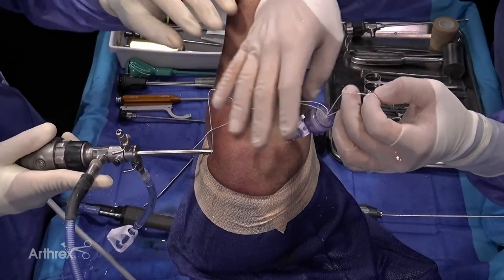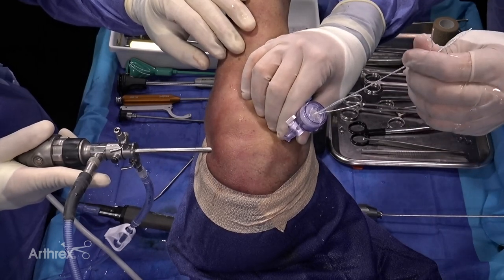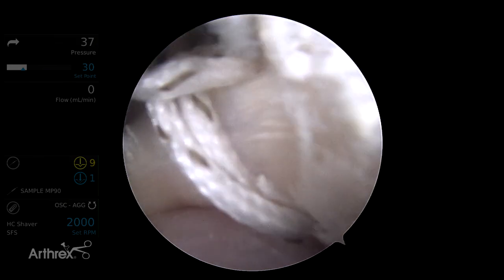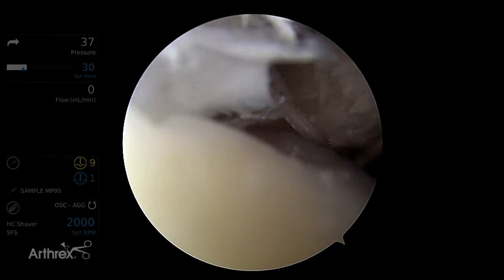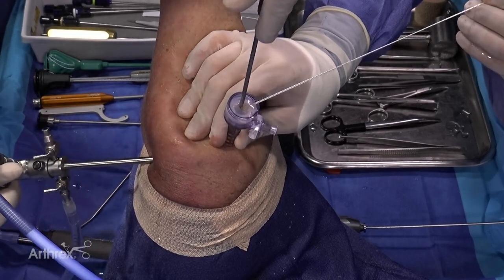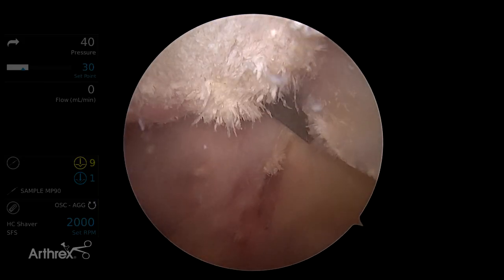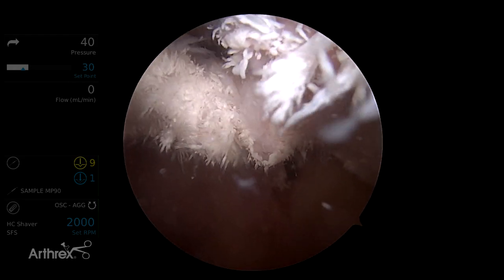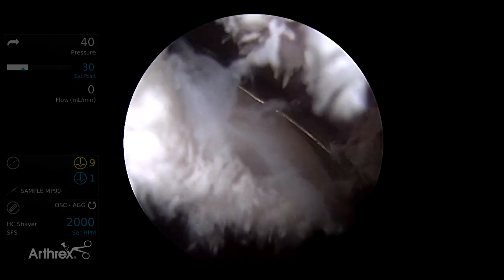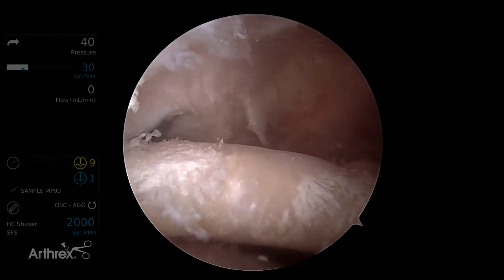You can see how you pass those limbs through the loop, and we'll alternate tension to bring that half-racking suture down to the biceps tendon — alternating tension will cinch the suture down to the tendon. I'll pull those sutures in line with the tendon and then cut the biceps tendon at the base, flush with the glenoid. We're going to preserve the labral insertion but just cut the tendon. Now the tendon is free and we can retrieve it out the ASL portal.